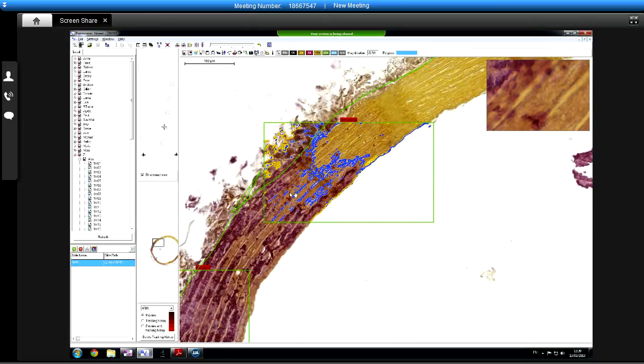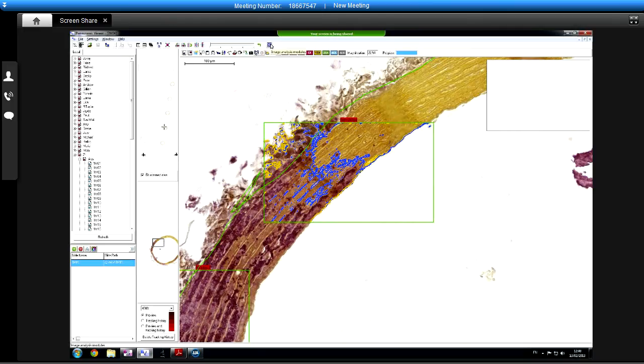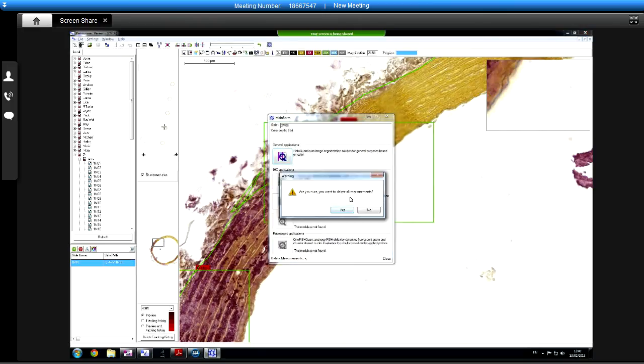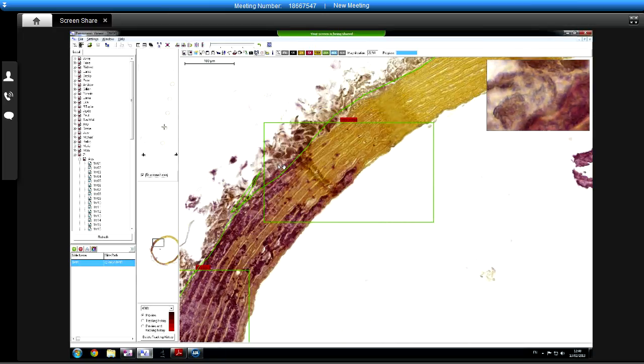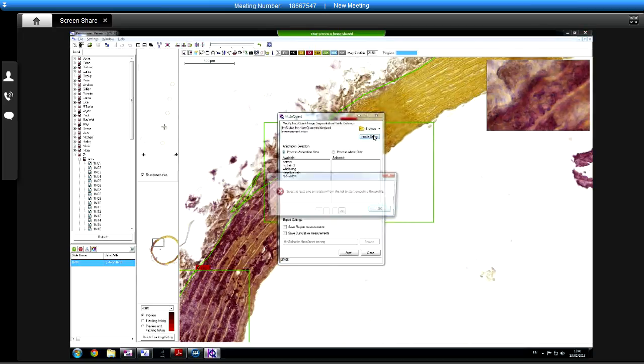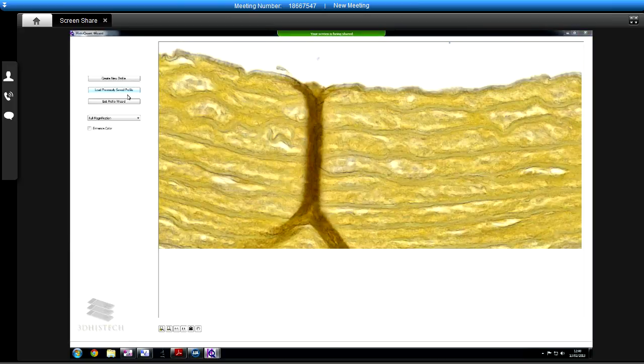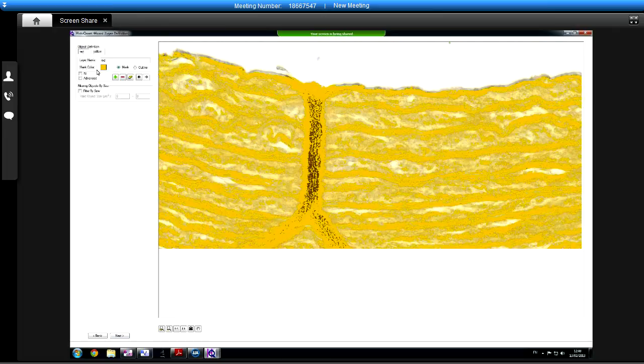So let's try that then. If I did that funny marking thing where I marked the whole area but excluded the middle, that's probably quite a fairly accurate area. Why don't we get rid of the red layer completely now? So we've just got the yellow one there.